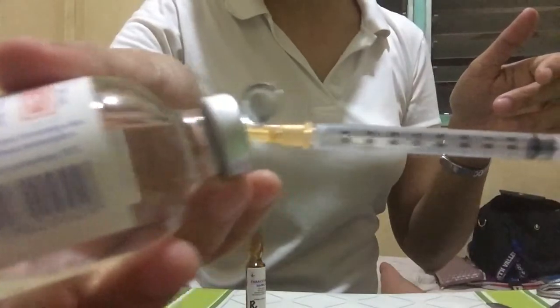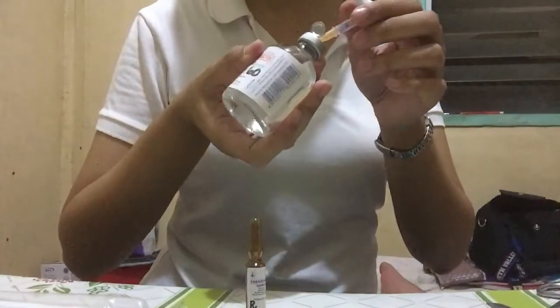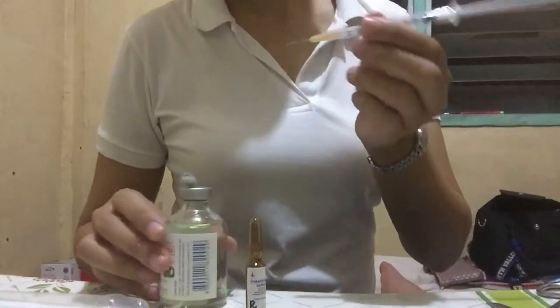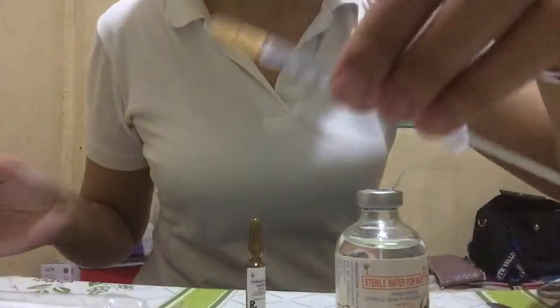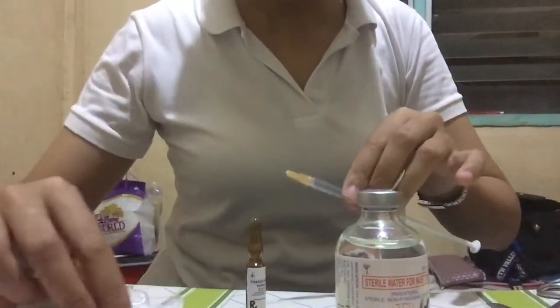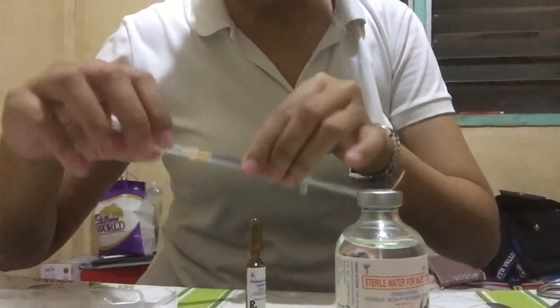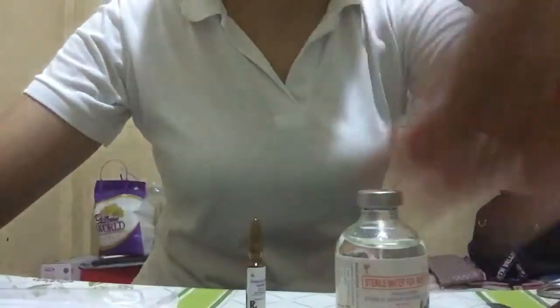So 0.9. Next is the ampule, so use a fish hook technique. Avoid unsterile area — do not let the needle touch the unsterile area.